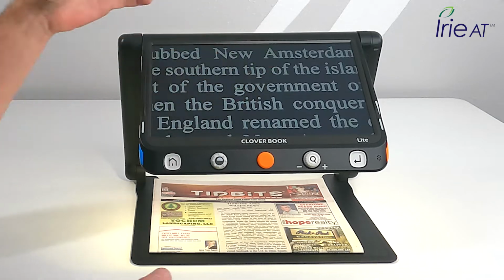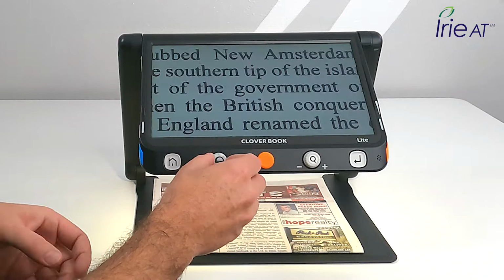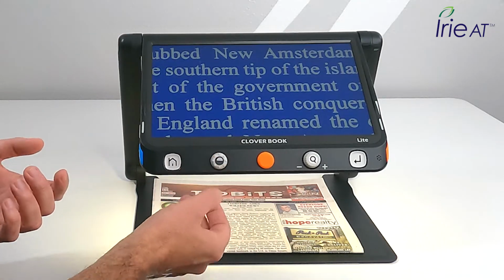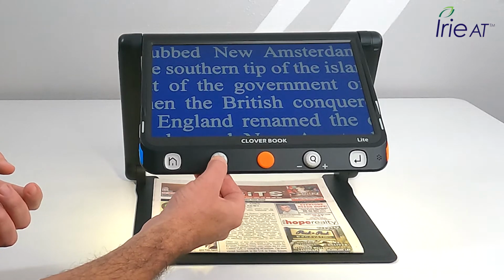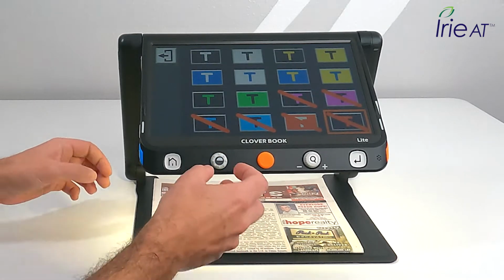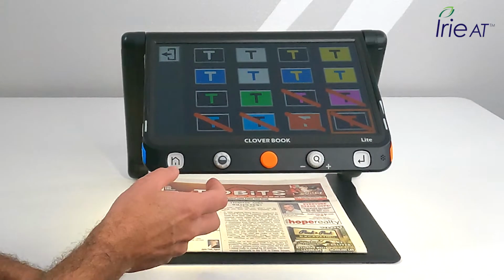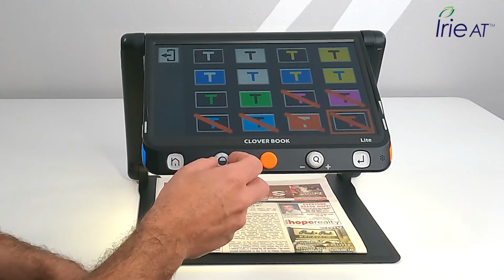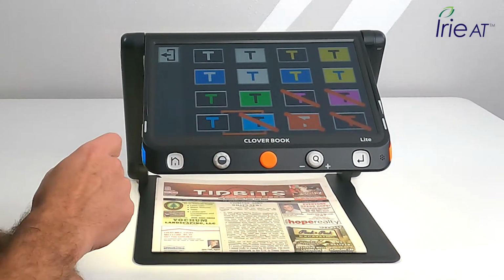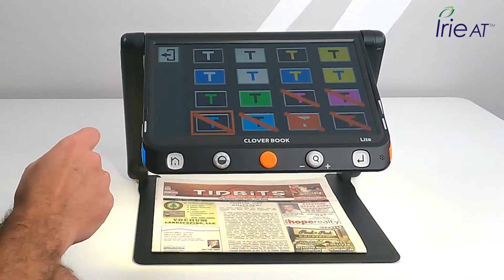Okay, other kind of thing you expect on a magnifier, there should be contrast. So I'm going to get some contrast going. I've got all sorts of different colors. I can long press on this button and I can get the menu that... customized color combination. So I should explain, in the contrast knob there's a button in the middle, and one of the features is to long press that, and then you've got this menu that comes up, shows you all the different contrast colors.